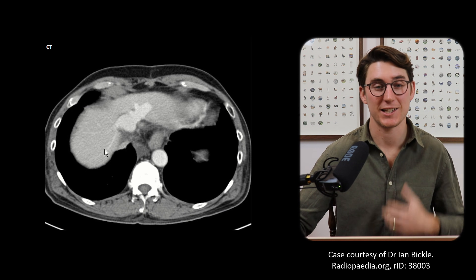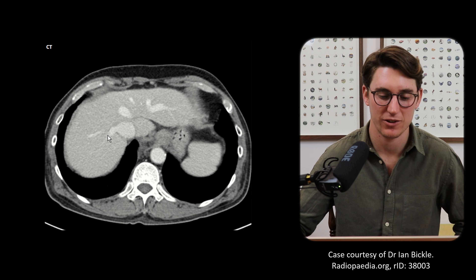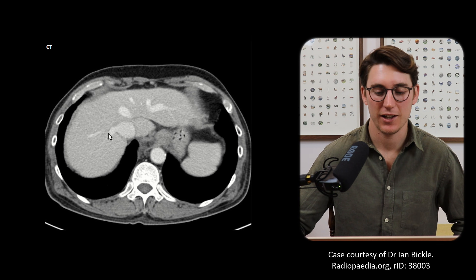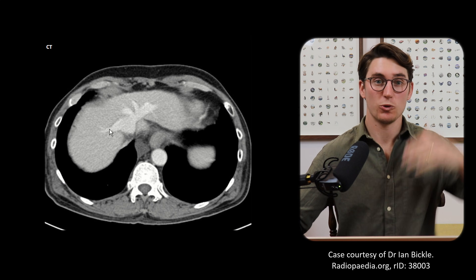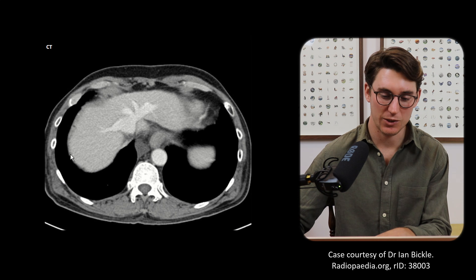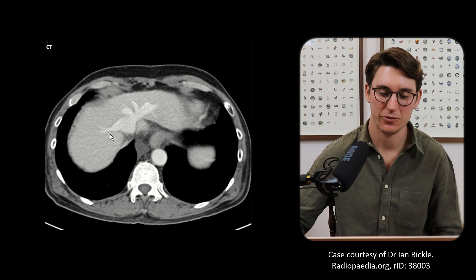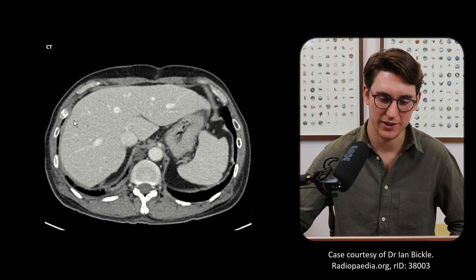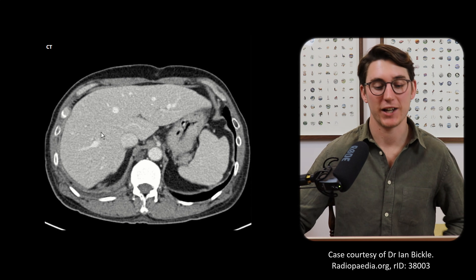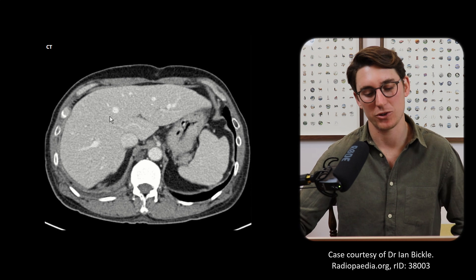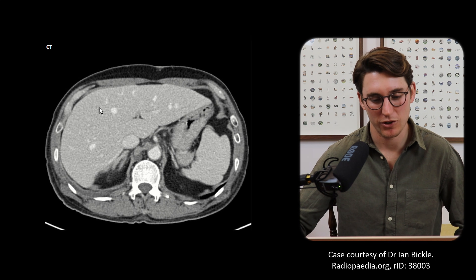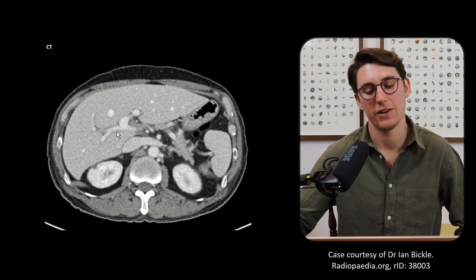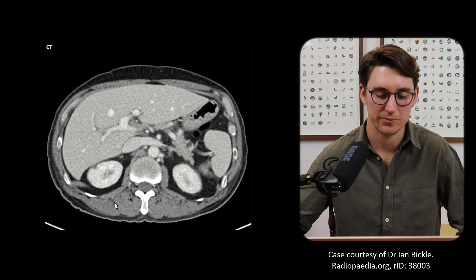That leaves us with our last segment — the segment anterior to segment seven. We can see our middle hepatic vein and our right hepatic vein, and we're superior here at the top level — actually into the thorax with our lung field visible. This segment all the way here, you can see why it's sometimes called the right anterior segment or the right medial segment. As we follow that down, this is all segment eight until we get to the level of the right portal vein.